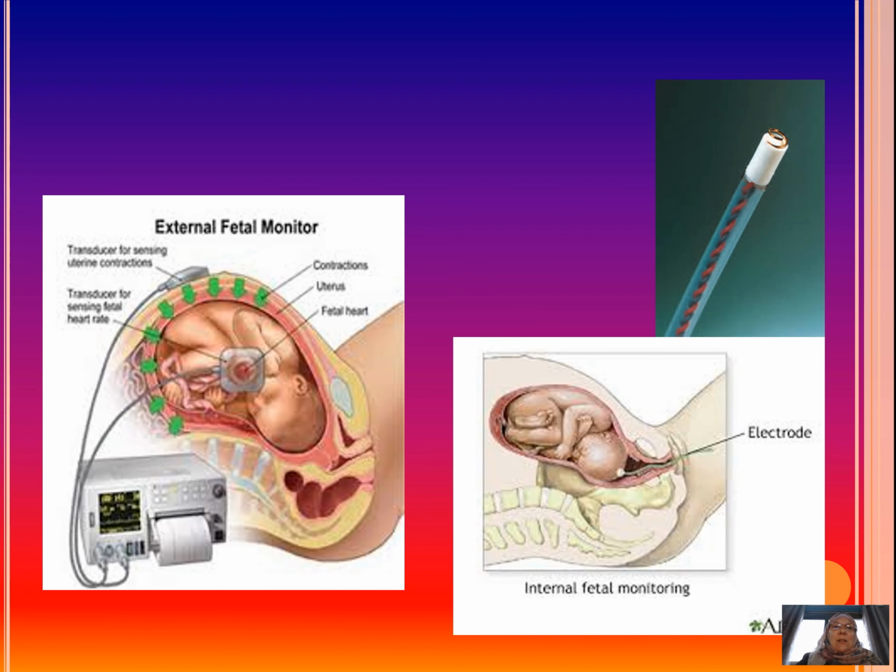There's a second transducer which is labeled US. It's a Doppler probe. It needs gel for functioning well, and it is put on the mother's abdomen to hear the fetal heartbeat.